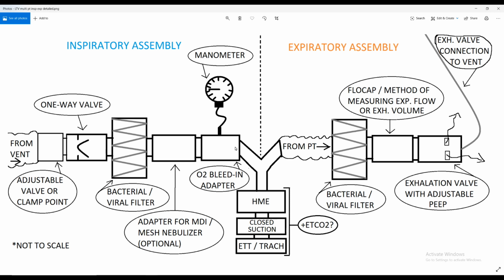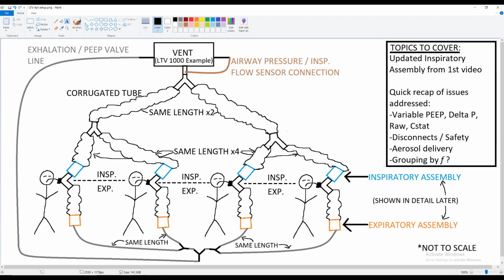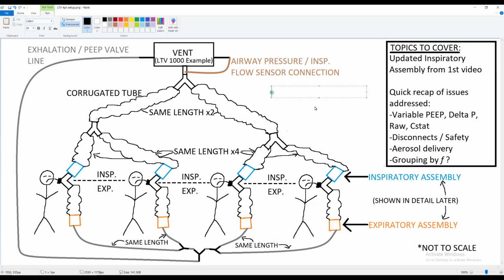So my theory is that this will only work in pressure control. So that's nice. It'll give every patient the same pressure, but that's also a drawback because it'll give every patient the same pressure, and these patients realistically might need different pressures. So we have the ability to monitor the pressure of each patient with a fair amount of accuracy at the airway. And then what that allows us to do, so I'll just make up some numbers here real quick. Let's just say we set them at, so here's my example. It's just PCV.